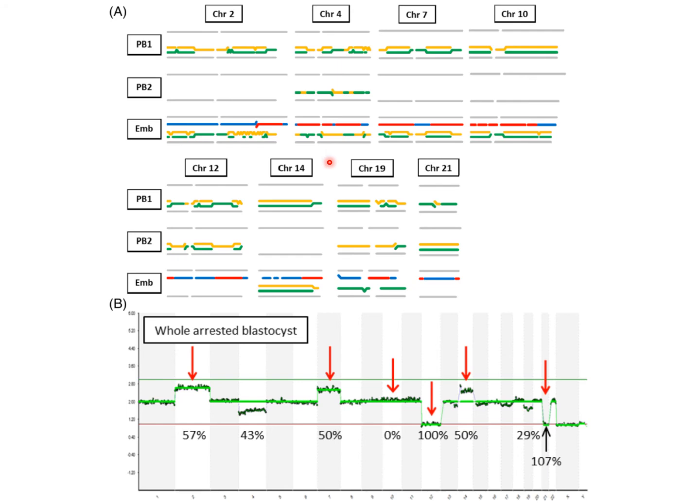And actually, if you look very closely, you can see that the segregation pattern is normal because around the centromere, which is indicated by the dot here, by the little gap here in the profile, we have the yellow bivalent retained in the first polar body and green chromatids in the second, exactly as you would normally expect.